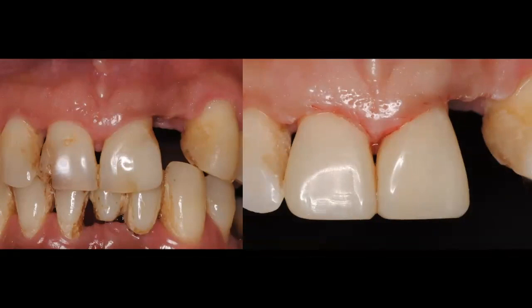You can see that there's some recession on the side. This is how the patient presented with his anterior teeth. He was missing a couple of other teeth in his mouth, but we were little by little going through different areas in order for us to improve some of these areas for him. And obviously, one of the areas that he wanted us to tackle initially was going to be this lateral incisor, because, as you may think, it has a lot to do with the aesthetic aspect of his smile.